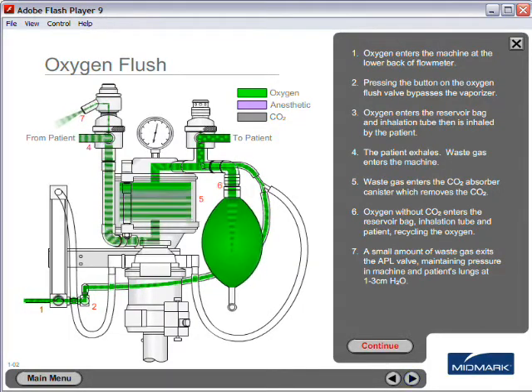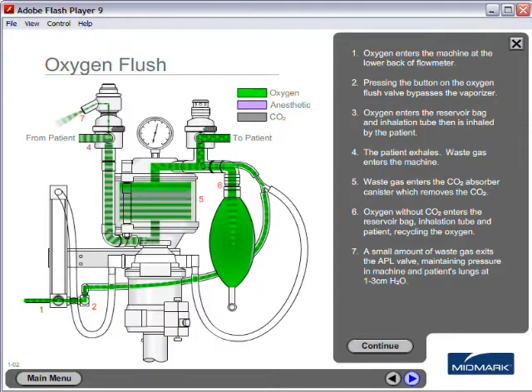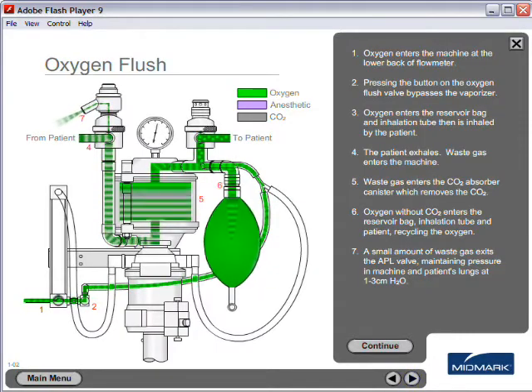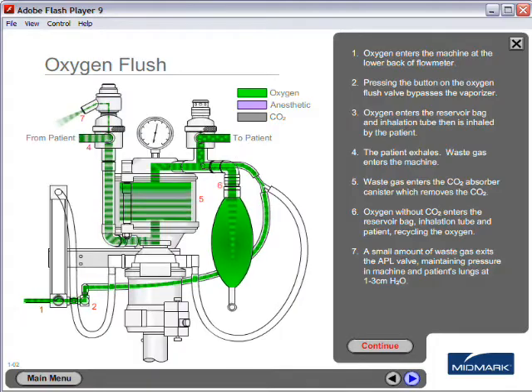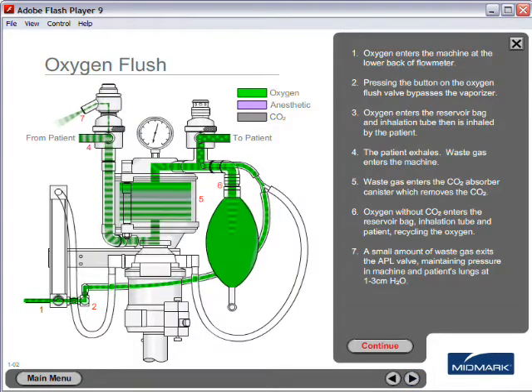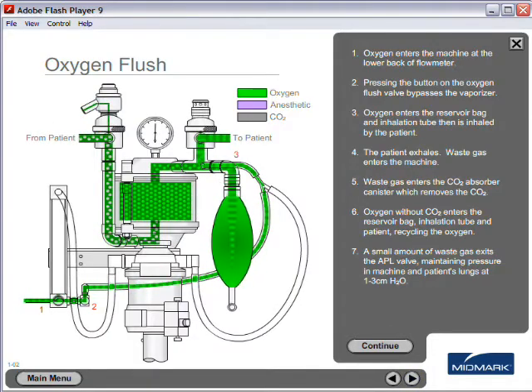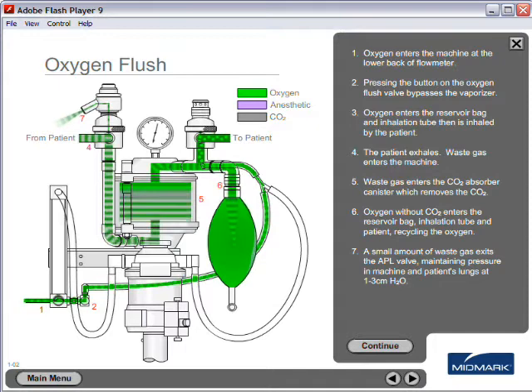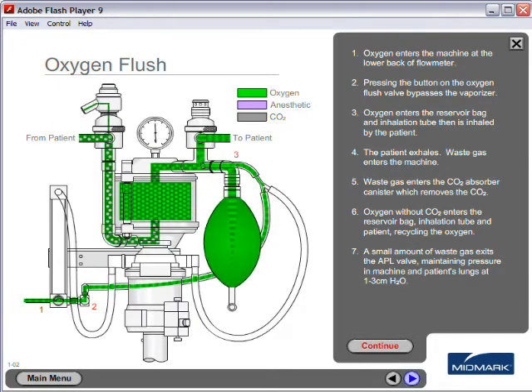Waste gas enters the CO2 absorber canister which removes the CO2. Oxygen without CO2 enters the reservoir bag and inhalation tube, recycling the oxygen back to the patient.